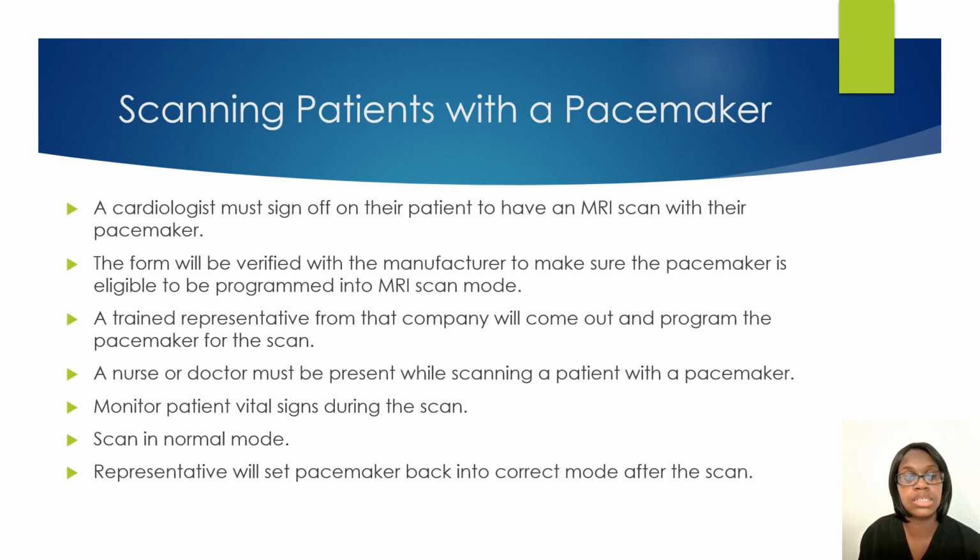So whenever you are done with the scan, whether you set the pacemaker or a representative comes out and sets the pacemaker, you want to make sure that it is in the correct mode after the scan. Do not let the patient leave the facility without putting it back into the correct mode, especially if it's one of those devices that has to be reprogrammed after the scan.